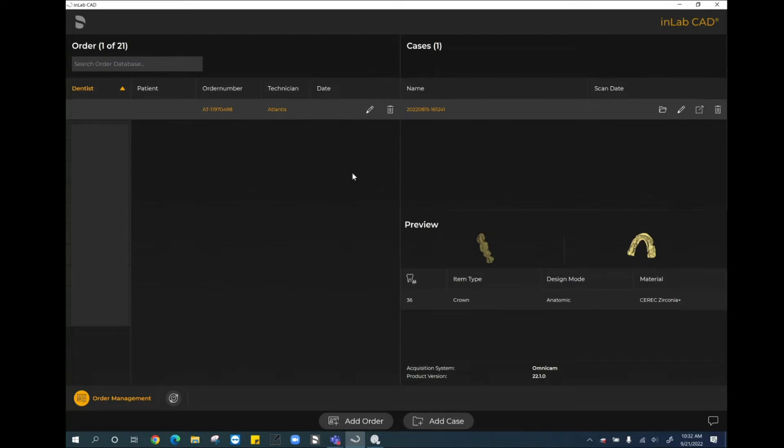Hello and welcome. Today we are going to look at the workflow for designing a surgical guide in the InLab software 22. Now it is worth mentioning that when you are designing a surgical guide in the InLab software or the CEREC software, it is a guide referred to as a CEREC guide. So it's either a CEREC guide 2 or a CEREC guide 3.